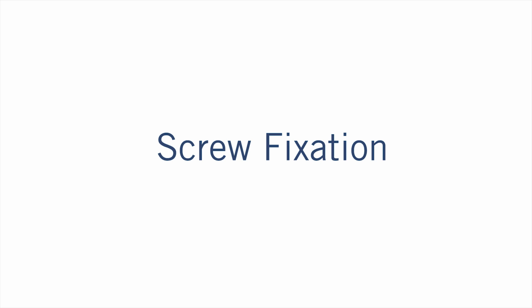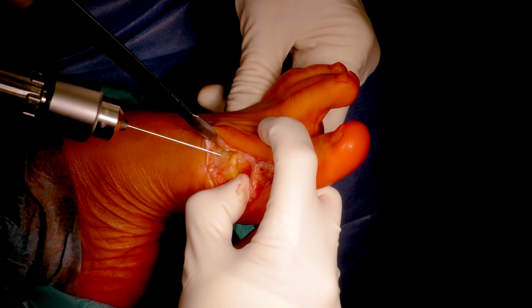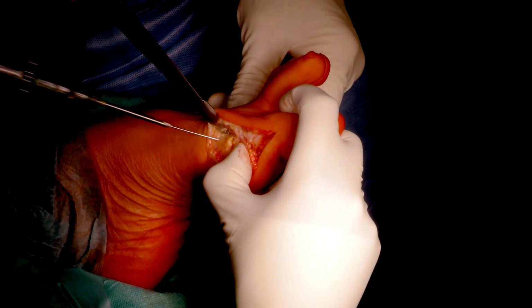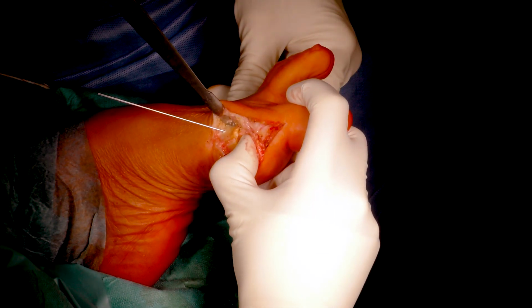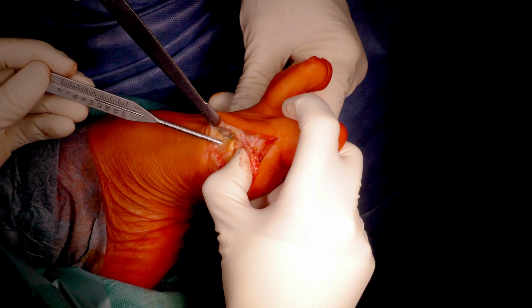Screw fixation. The metatarsal head is fixed in the desired position. A K-wire is aimed in the center of the metatarsal head. The achieved position can be checked by X-ray. Countersinking is recommended not to crack the dorsal corticalis during screw insertion.